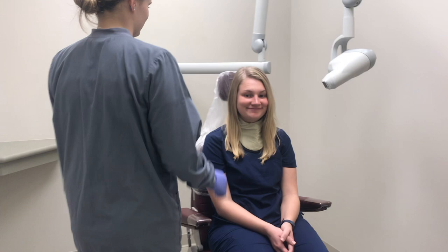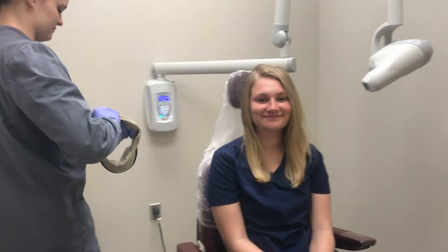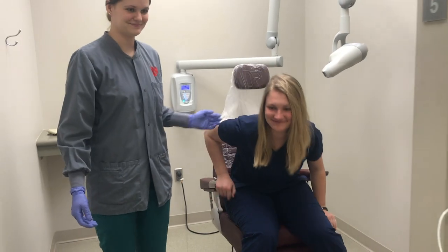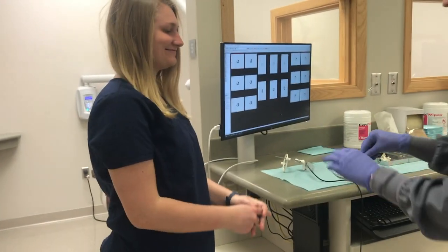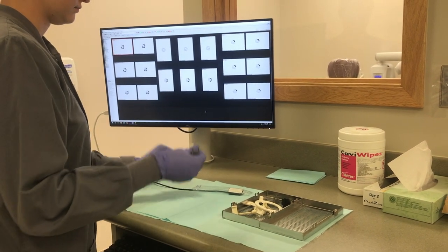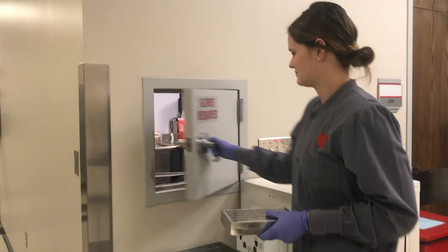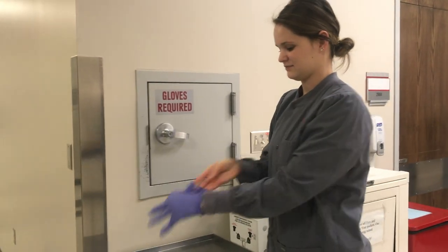Remove the thyroid collar and dismiss the patient from the chair. Remember to give glasses and removable intraoral devices back to the patient. Disassemble the beam alignment device and put all the pieces back into the cassette. Place the cassette down the chute for sterilization and throw away your contaminated gloves.